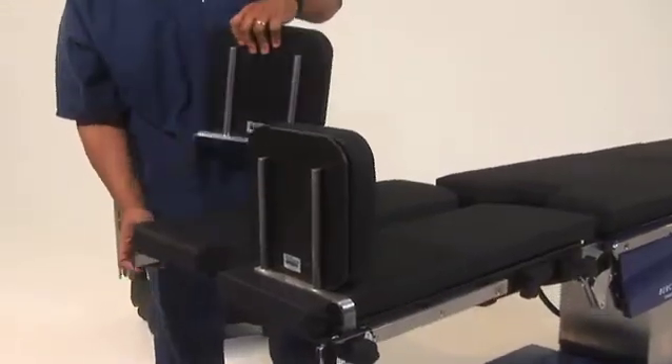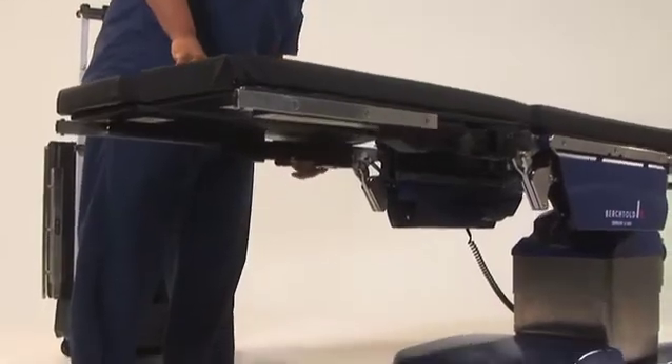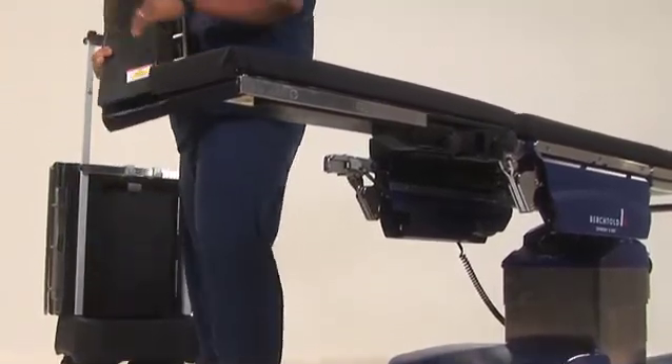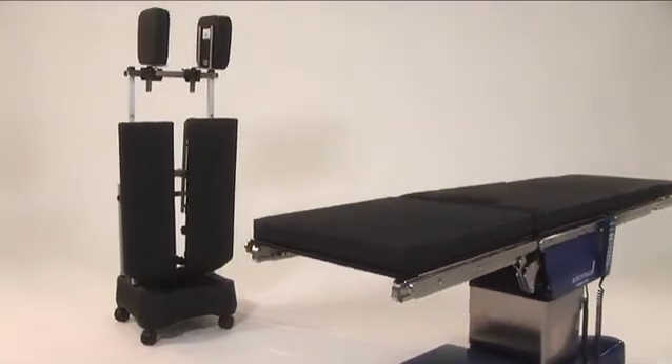Once the patient has been transferred, remove the foot pads, loosen the knob securing the leg assembly to the table leg spar, release the lock on the underside of the assembly, and pull the leg section away from the table.